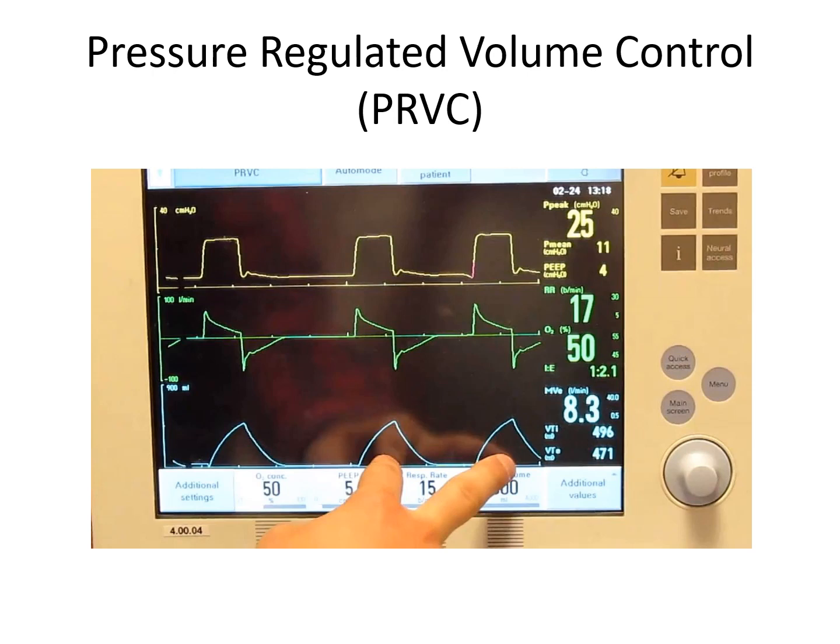So in this mode, you have pressure regulated volume control. We call that PRVC, which oftentimes you'll see a lot of patients on. It provides a controlled ventilation in the absence of patients' respiratory effort, and the ventilator will give a controlled volume. So with this combination of pressure and volume control, it delivers that preset tidal volume with a preset respiratory rate, and a preset tidal volume is delivered at the lowest possible pressure, or a preset pressure. So there will be upper pressure limits.